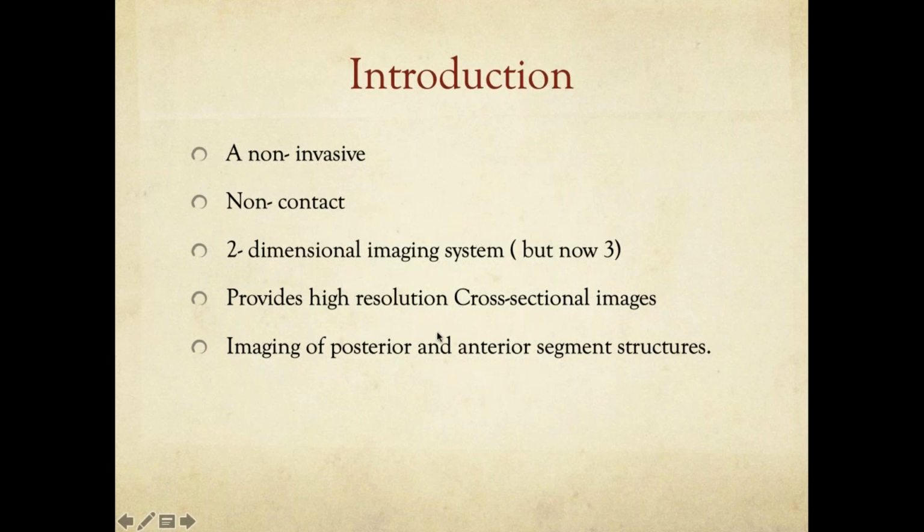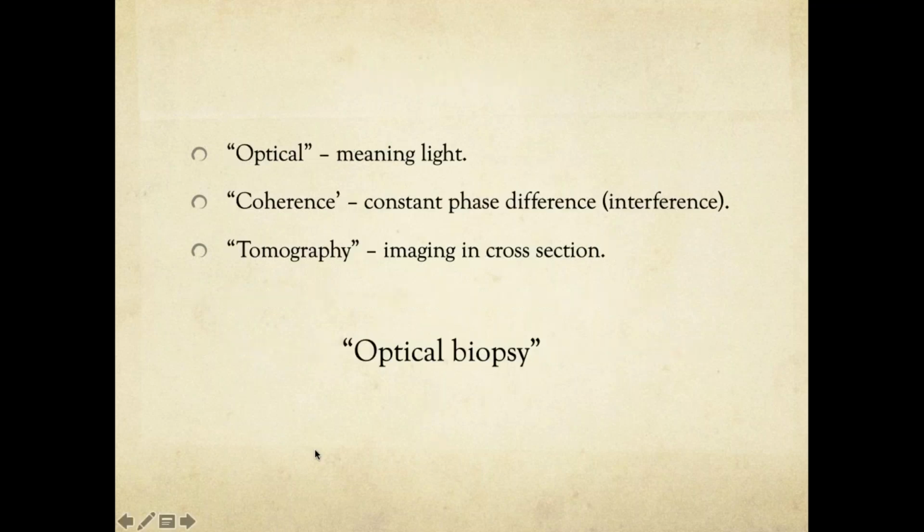High definition is the resolution as well, but again, it also talks about much clarity. So don't confuse high definition with resolution. High definition is something else. Resolution depends upon the minimum distance between two objects at which you can still say that these two objects are different. So this I'm not going to talk about.